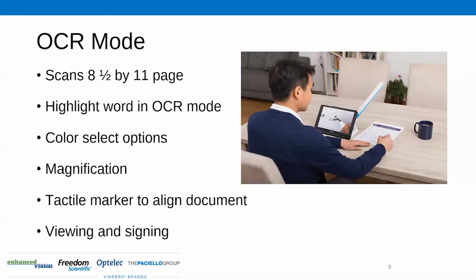And then, to touch on that reading functionality you mentioned earlier with just that one line of text, it's nice that you can change it from that one line, or you can do it to just text, or you can do the live view and view it as the live image with highlighting on that image. It's nice to have that flexibility. And on top of low vision, if some have reading or writing issues, if they're struggling with reading, cutting it down to that one line of text just makes it less intimidating, and cuts down on the anxiety of having to read a full page of text, where now they're taking it in smaller bits as just a line. So it's nice.